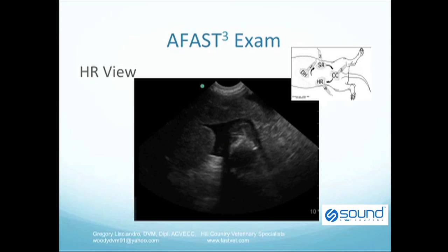This is called the big lie because the liver is not searched out, neither is the right kidney. If the right kidney is to be imaged, then the patient is usually lifted up a little bit off the table or they're rotated to left lateral recumbency to image into that retroperitoneal window. In most instances, the right kidney is not directly imaged unless the clinical status of the patient indicates it is necessary, such as blood in their urine or any suspected retroperitoneal injury. Otherwise, imaging the left kidney is usually adequate for a window into the retroperitoneal space.